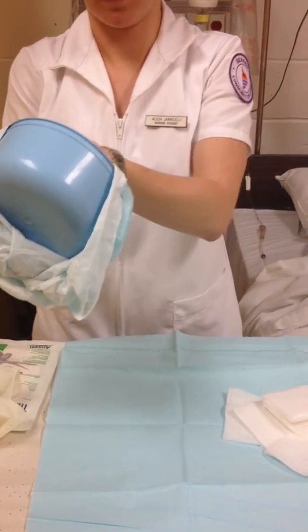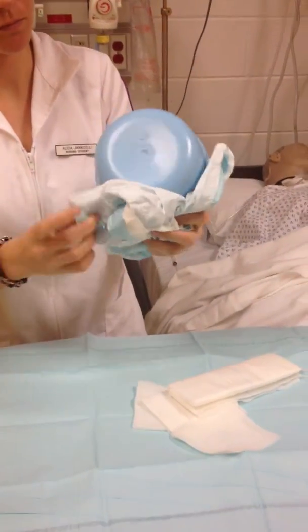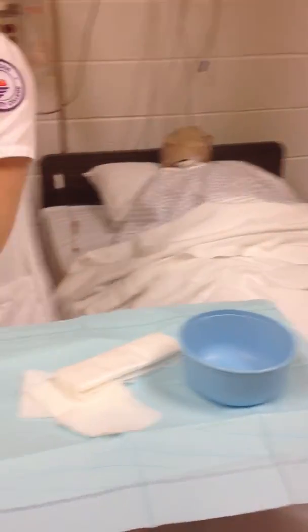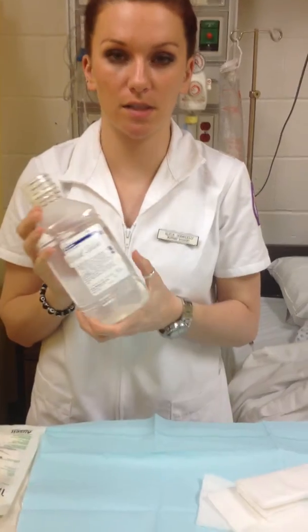Now I'm going to take my saline — this is a brand new bottle — so I'm going to open it. I'm going to mark the date, time, and our name. After 24 hours it needs to be disposed of.